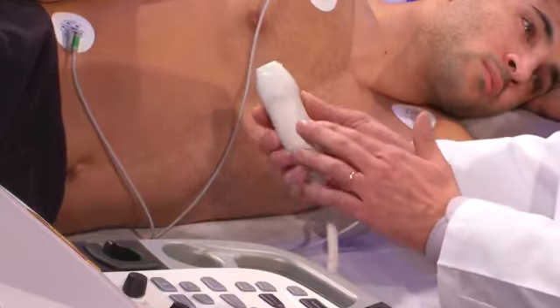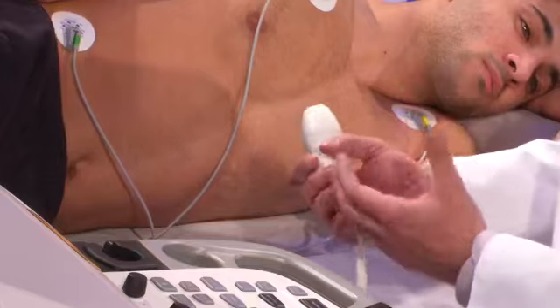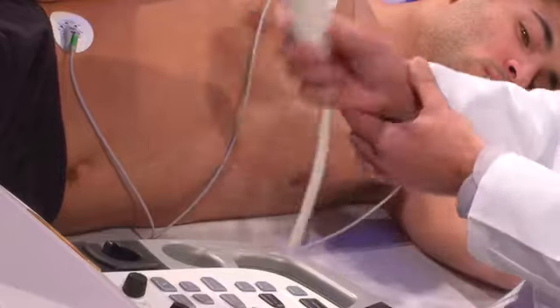Because of the size, it's sometimes difficult to have a good window. Of course, today we have a strong guy, but if you have a small patient, you may have difficulties getting a good window because of a small intercostal space, and you cannot avoid some rib artifact. Moreover, the probe is quite heavy, so for a doctor like me with fragile wrists, it might sometimes be a little bit difficult to make a complete examination with this probe.